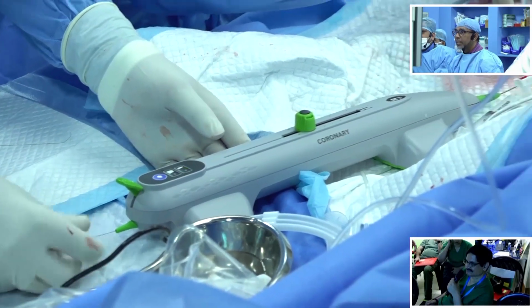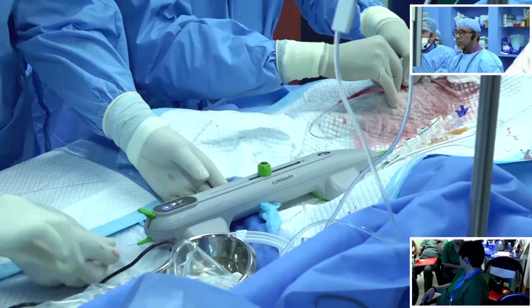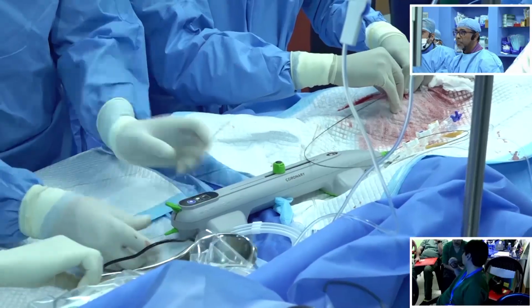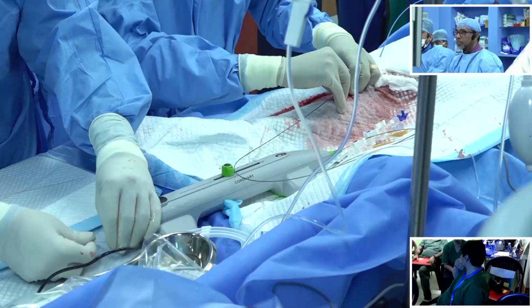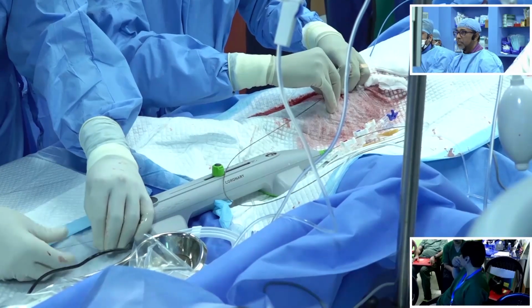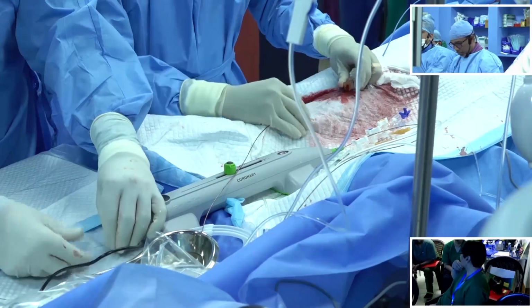Next wire, Anisha. Wire inside. Okay, it's come out.